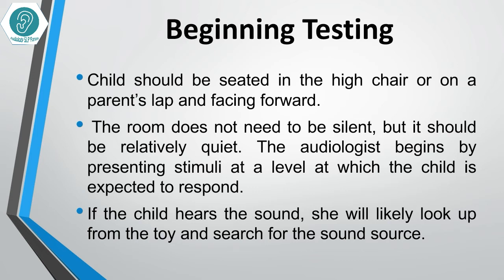The audiologist begins presentation of a sound at a level at which the child is expected to respond. If the child hears the sound, she will likely look up from the toy and search for the sound source.